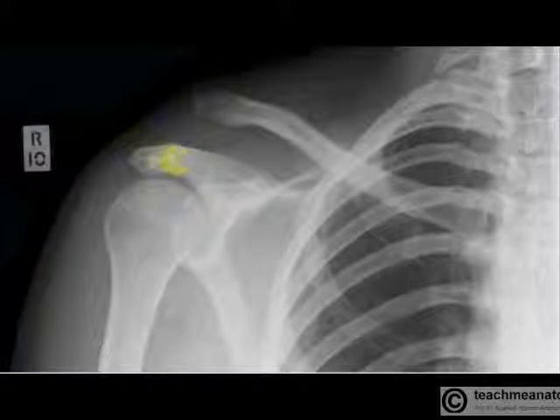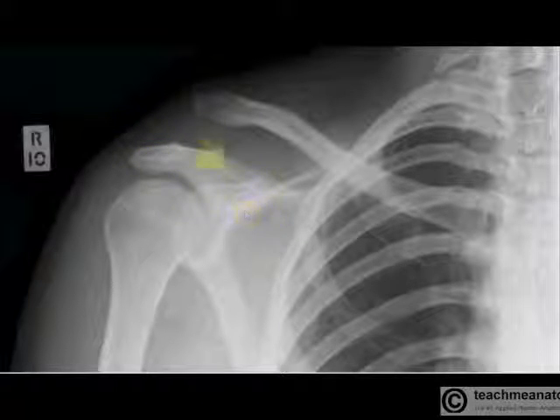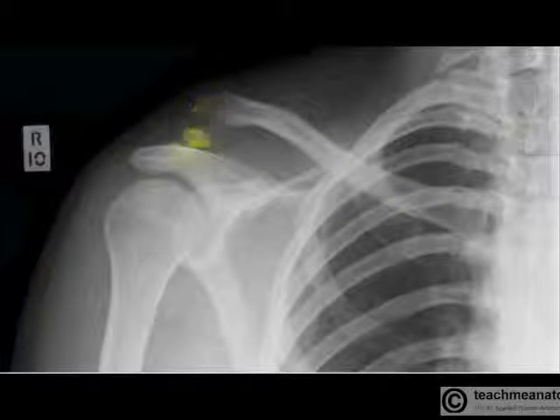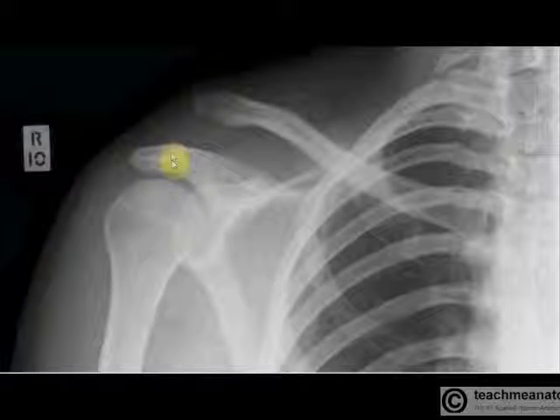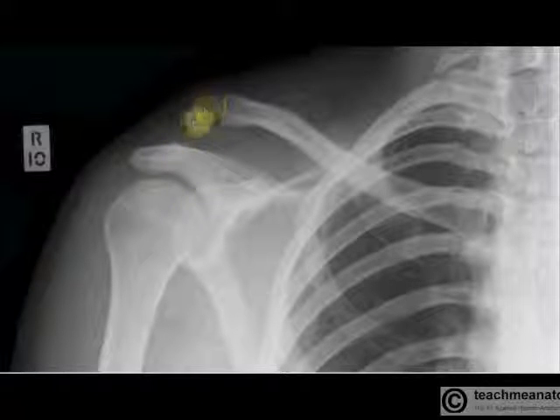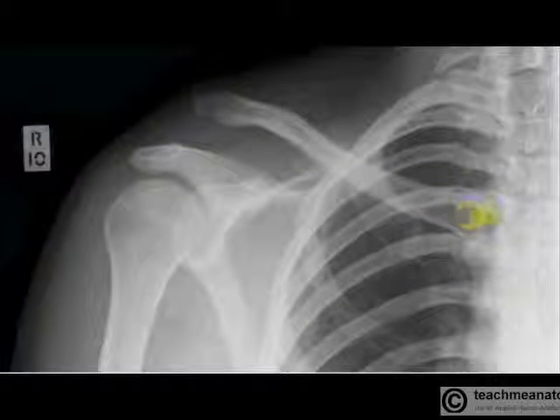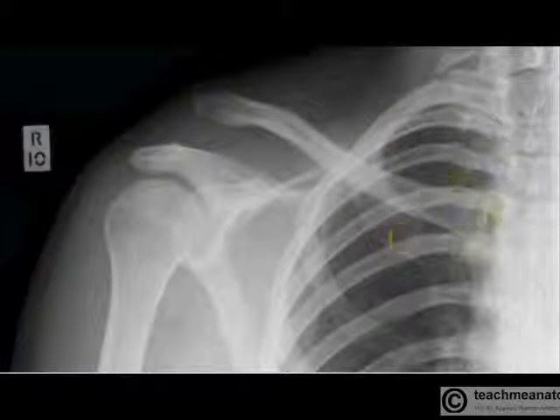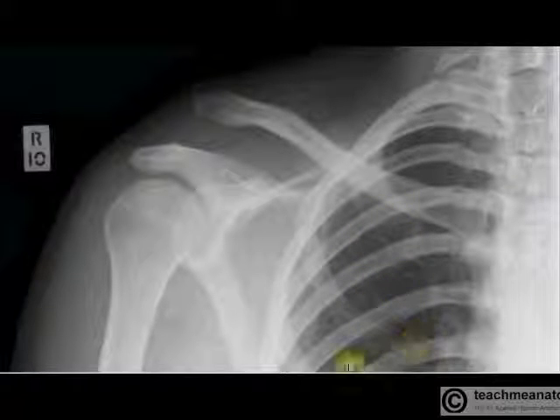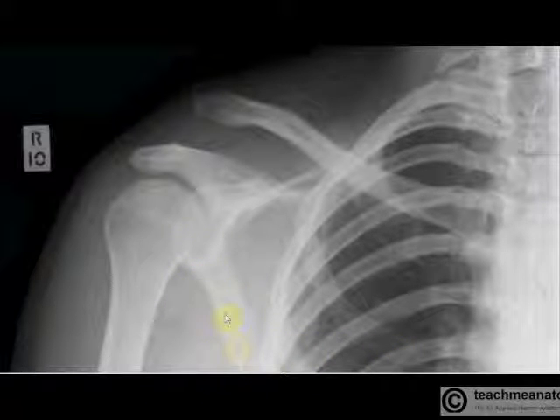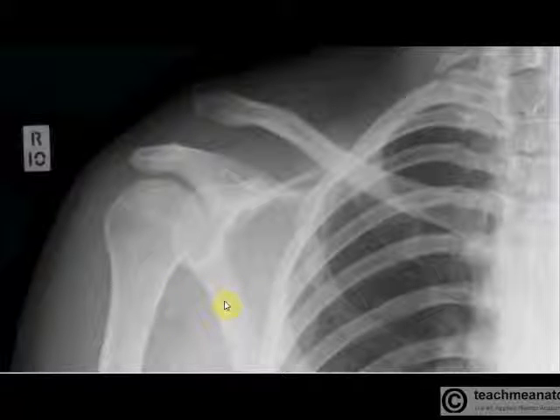Now we move on to the acromion of the scapula, and there's the coracoid of the scapula. Here's the clavicle — you'll notice in this x-ray the clavicle should articulate at the acromioclavicular joint but is not; it's an acromioclavicular joint dislocation. Here's the length of the clavicle, there's the sternoclavicular joint. Here are ribs and you can see the black lungs within with some lung markings. There's the lateral border of the scapula coming up there.